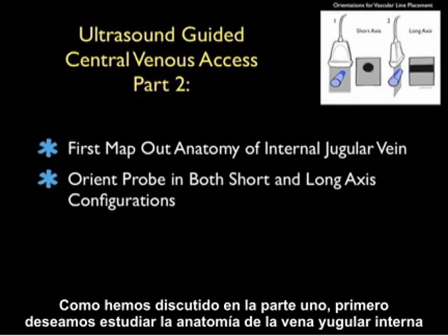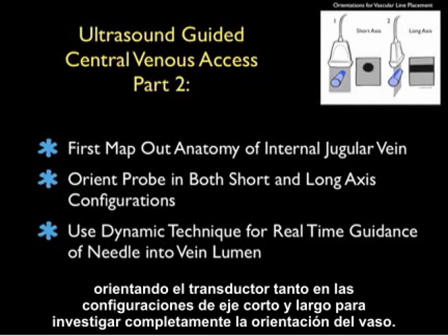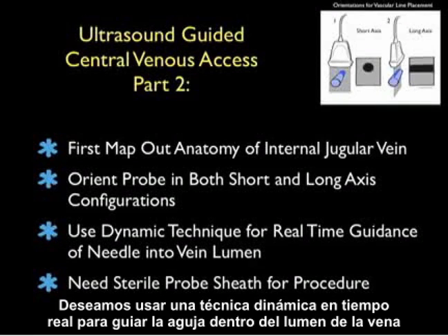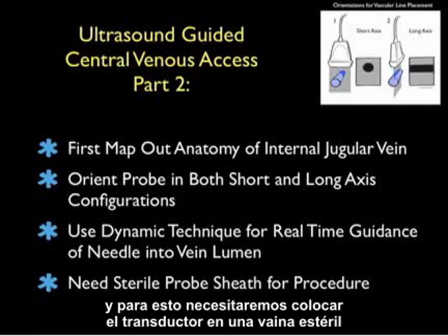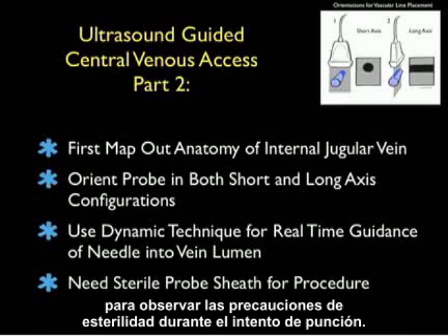As we discussed in Part 1, we first want to map out the anatomy of the internal jugular vein by orienting the probe in both short and long axis configurations to fully investigate the orientation of the vessel. We want to use a dynamic technique for real-time guidance of the needle into the vein lumen, and for this we'll need to place the probe into a sterile sheath barrier to observe sterile precautions during the puncture attempt.